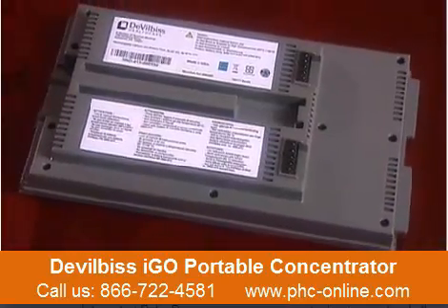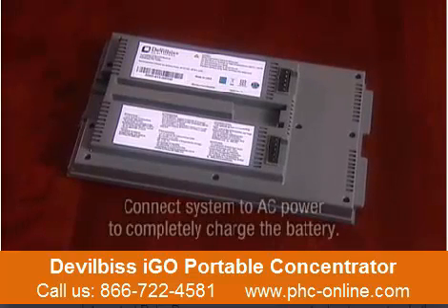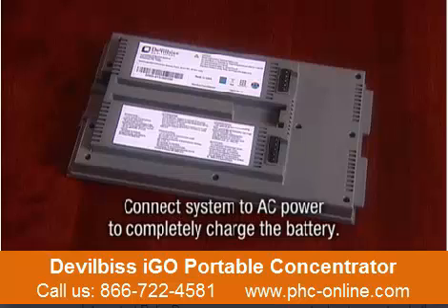Also keep in mind that the new battery packaged with your iGo system is not fully charged. Connect your iGo system to AC power to completely charge the battery, which may require up to 4.5 hours of uninterrupted charging.